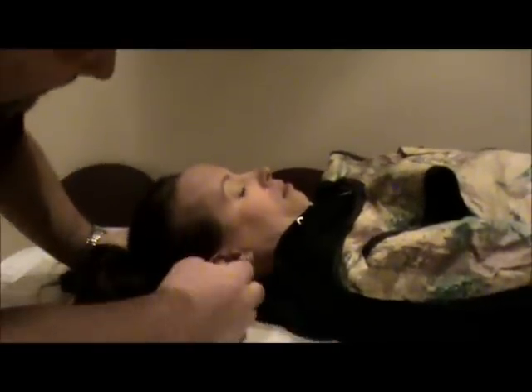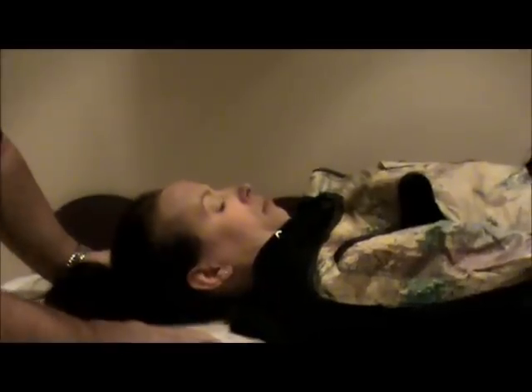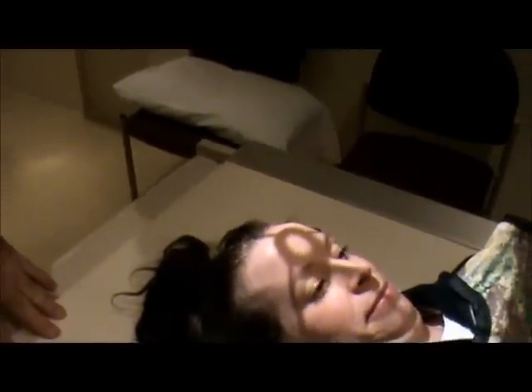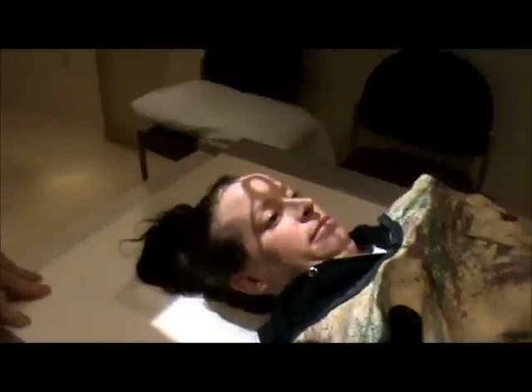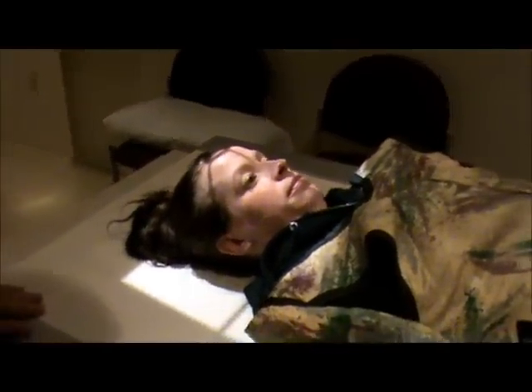I'm going to try to get the patient's head straight and have her tuck her chin down. I'm going to look at the OML — the orbitomeatal line — and she's able to get it perpendicular. Once it's perpendicular to the IR, we're ready to center. I've already got our tube angled 30 degrees centered to our film. I'm going to center about two and a half inches above the glabella, which is about the level of the hairline.